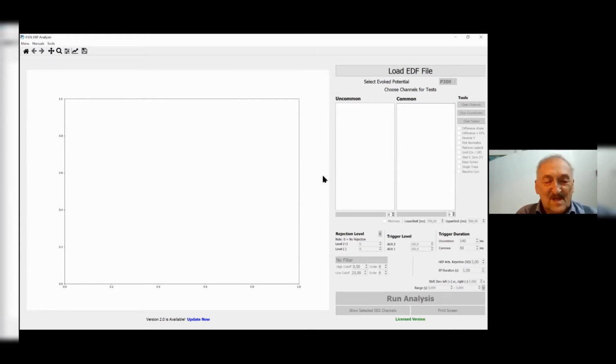My dear audience, my name is Dr. Christoph Garner. I am a neurologist, and in the last years I have developed, together with Mr. Feiner and the Institute IFEN, a program where we can analyze event-related potentials, ERPs, in a much simpler manner than was possible before.